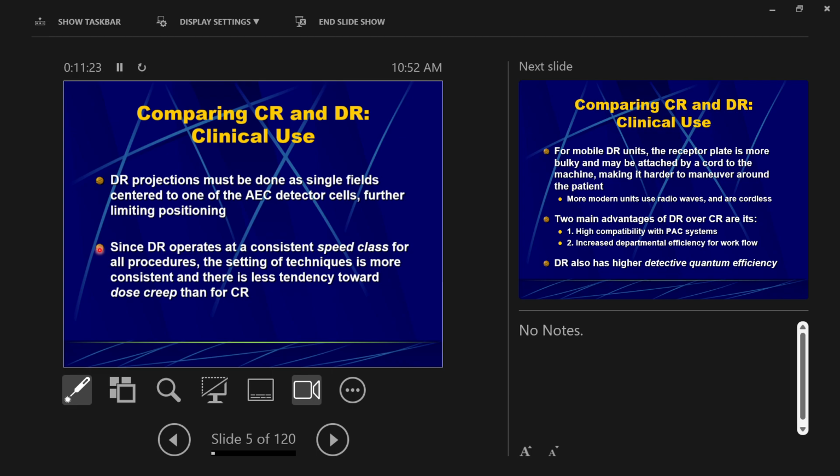Again, you're still thinking film cameras, photography. If you instead bought a 200 speed film, you were able to make the exposure quicker. So in conditions of low light, you were able to make the exposures faster, but you sacrificed image quality. So speed class of film was taken from film photography, where we wanted to be able to control how fast our film and cameras were exposed, and we gained or lost detail in that same way.